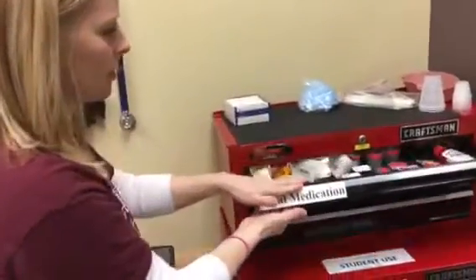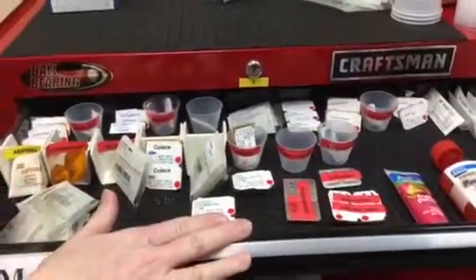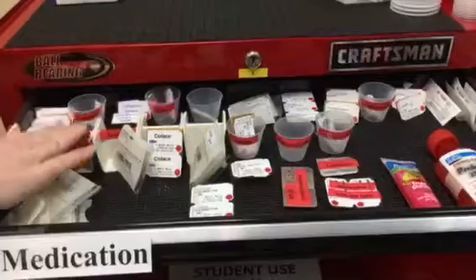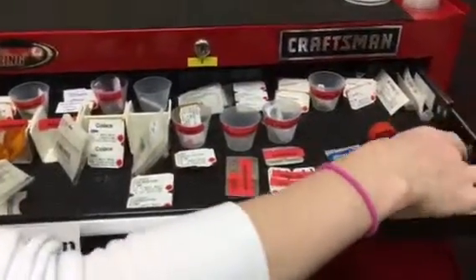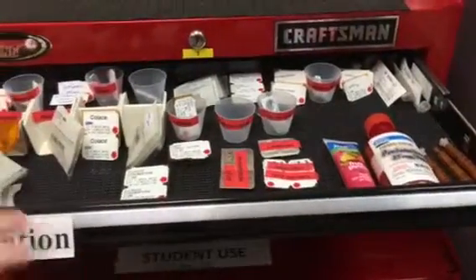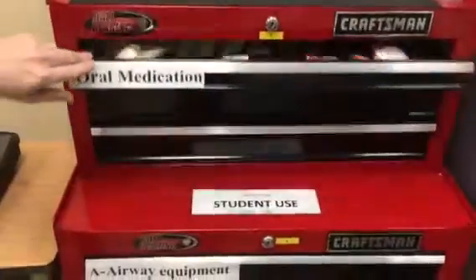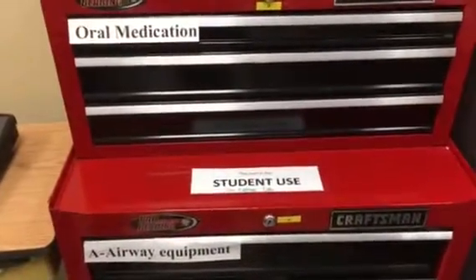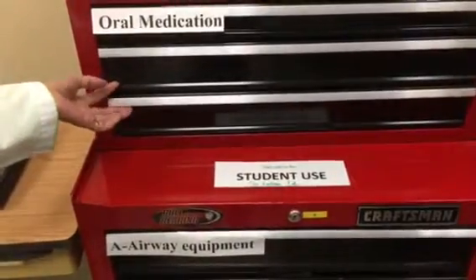So to start, the top drawer is oral meds. Any oral medication you may need is all in here. There are slots which say what each one is. Here's liquid, and here you would have a syringe to draw that up if needed. For RN students, we may not use the oral medication, but it is very important that you know the IV therapy.